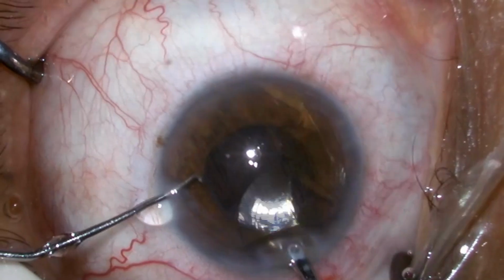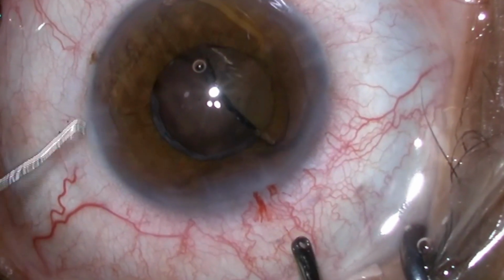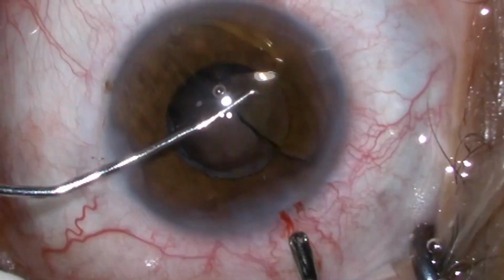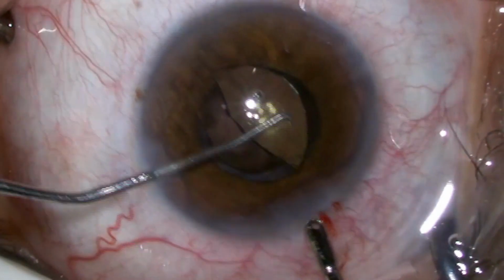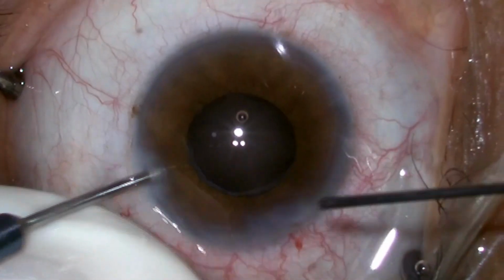This is the first part we have taken out through the main incision, and the second part is also out.